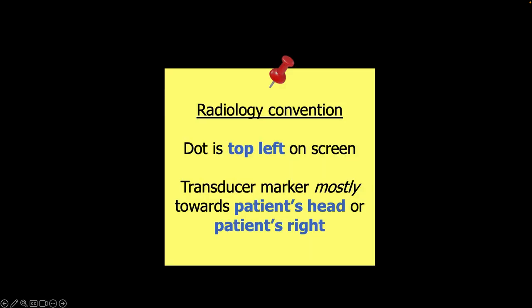It's not always easy to see where the indicator is on the transducer, and each manufacturer has a different way of marking that indicator. So when in doubt, instead of just tapping on the transducer, which could damage the crystals, place a little bit of gel on one side of the transducer, and the side that lights up or shows up on the screen is the indicator side.